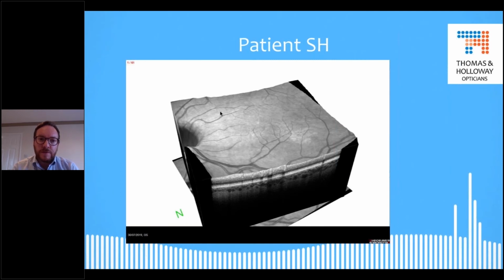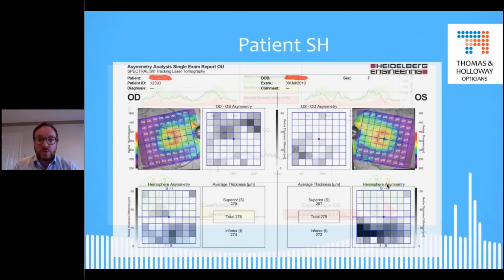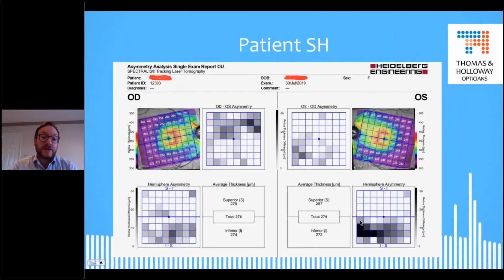The retinal nerve fiber layer, because it's thinned, has lost some of its reflectivity, and it's very difficult to see on this image, but you can actually see that that's formed into a slight gully. So this position in the temporal inferior optic nerve head is consistent with the positioning of the GCL just here, and it's consistent with the change that we would expect with this thinning and hemisphere asymmetry here.